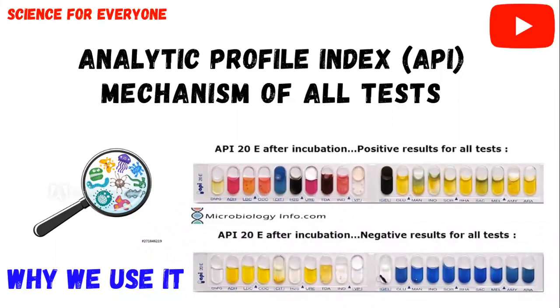Today the lecture is about the Analytic Profile Index, in simple form the API kit. Basically, these tests are performed by the microbiologist to confirm the specific microorganism that is involved in a special type of infection. So in today's lecture, we will discuss the mechanism of the test, how it is performed, and why it is important to perform this type of test. So let's start with the video lecture.